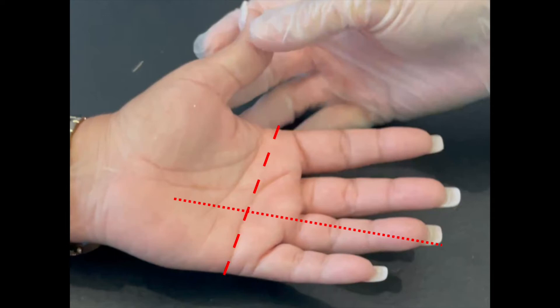When the two lines are superimposed, you mark where the A1 pulley is found. The injection should go in this little circle that we've drawn here, which is in the area of the A1 pulley for the ring finger.